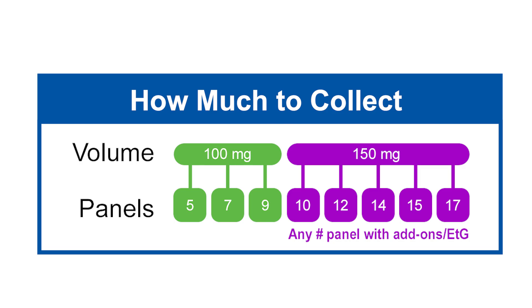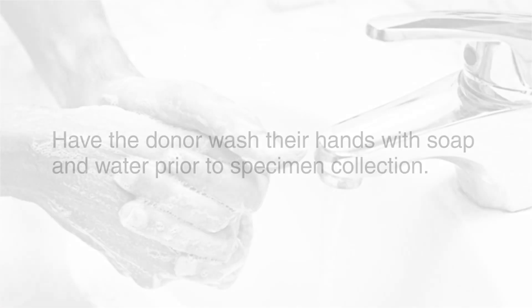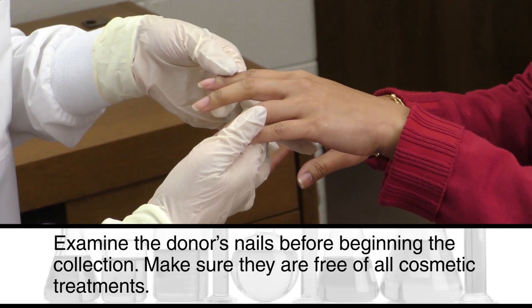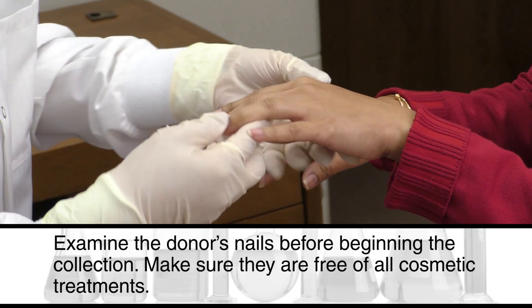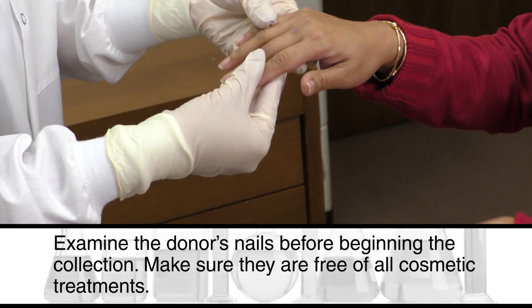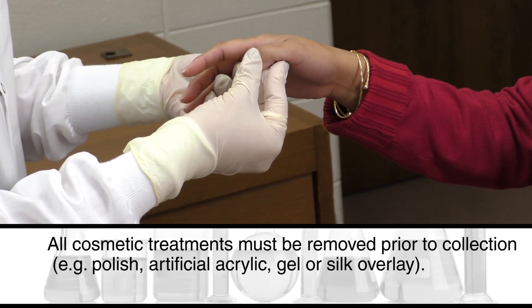A gem scale is highly recommended. Prior to each collection, wipe the clippers with a non-ethanol based alcohol pad. Have the donor wash their hands with soap and water prior to specimen collection. Examine the donor's nails before beginning the collection and make sure they are free of all cosmetic treatments. All cosmetic treatments must be removed prior to collection.